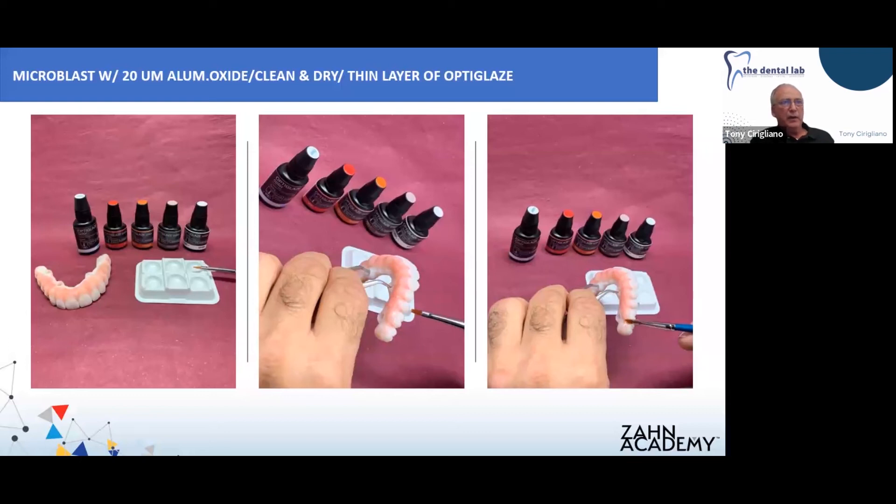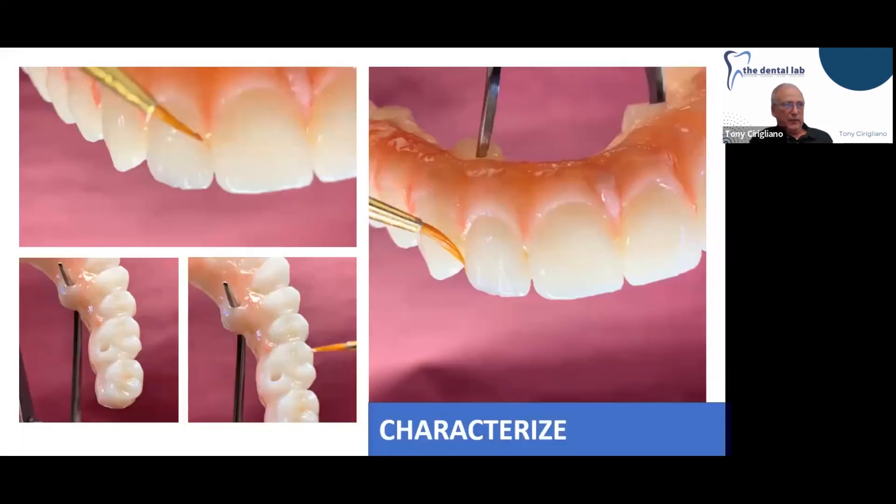Optic glaze comes in two viscosities — heavy and regular. Try both and see what you like. The heavy will tend to fill in your embrasures or interdental areas a little too much, so you want to avoid any puddling so your restoration stays individual. I like to use the thinner material. We use just a couple of shades to characterize the case — red/orange optic glaze color, violet, and a little bit of white. You don't need to cure your glaze before you start applying your color or stain.